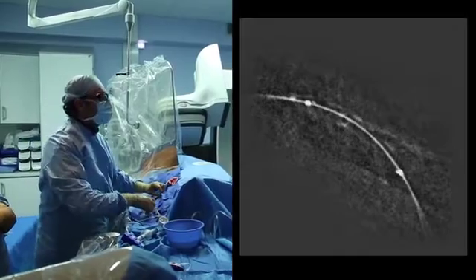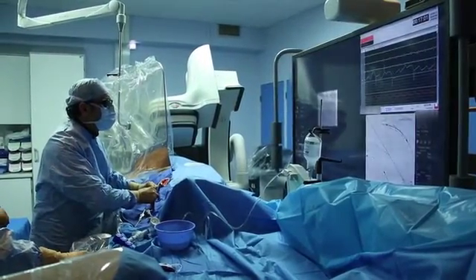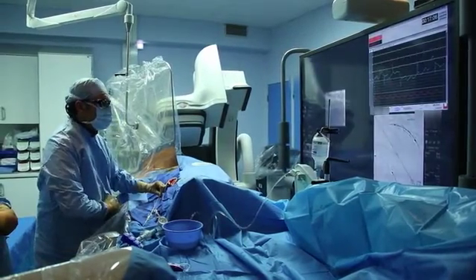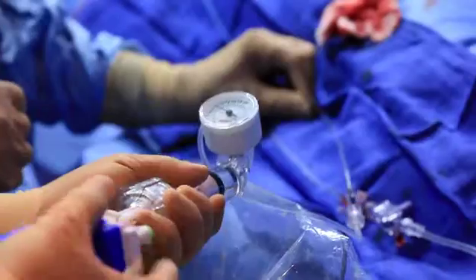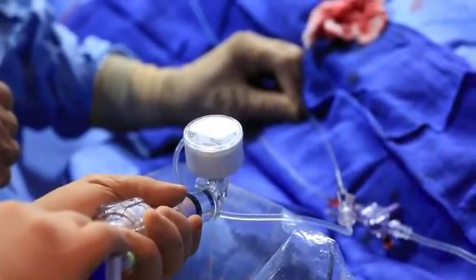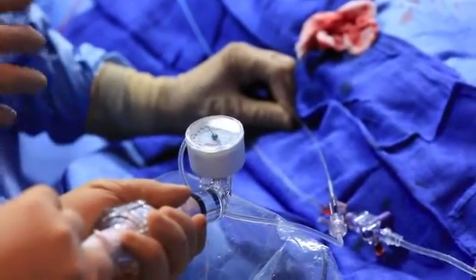You can clearly see the BVS with the markers of the balloon and the coronary artery with the stenosis. It is easy to check and be sure that we are covering all the stenosis. As you saw on the previous picture it was not the case, so I have to put it more distal. Then we will put inside a non-compliant balloon to be sure that the BVS is well deployed in the coronary artery.